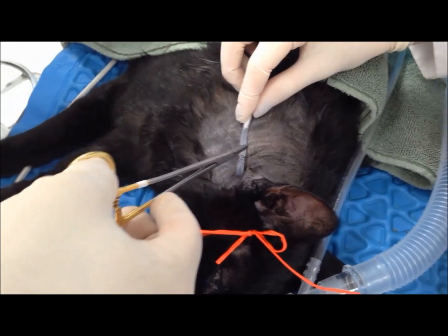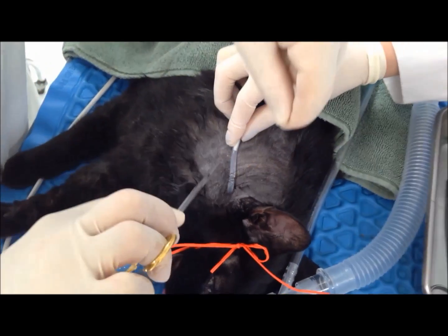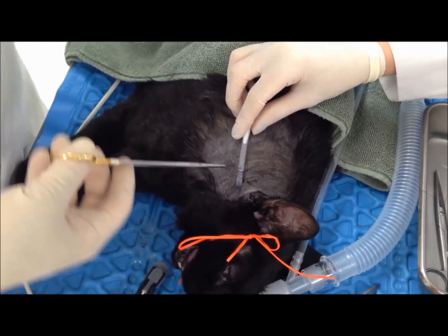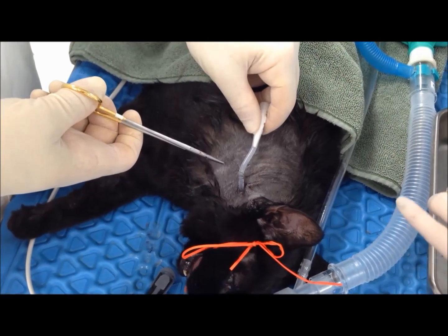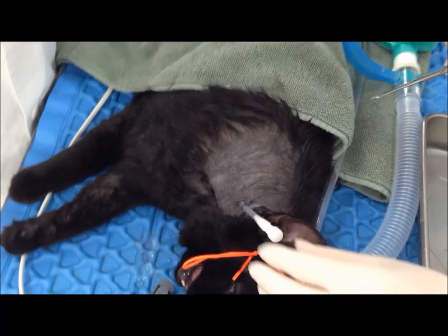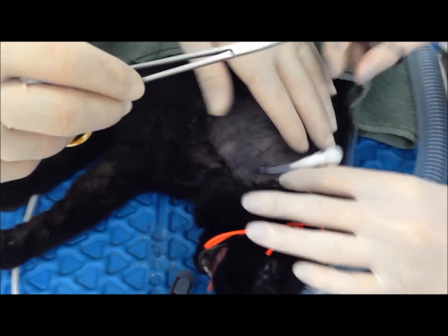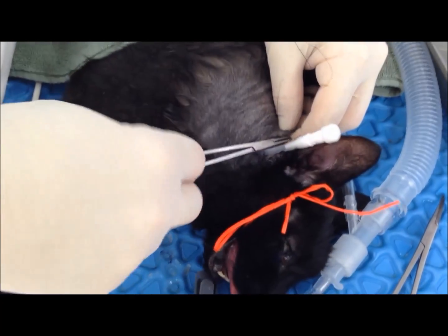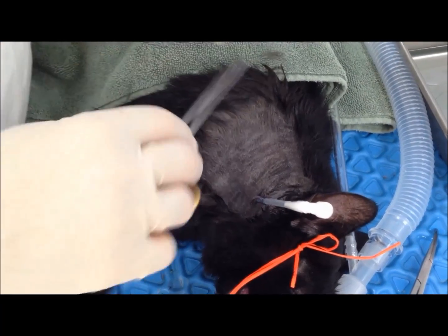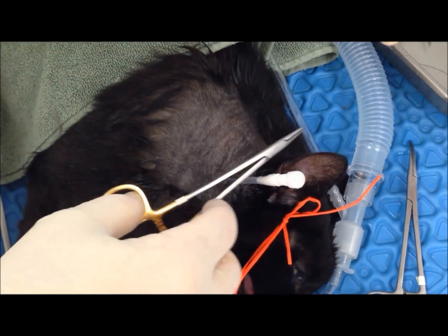It's slipperier than it usually is. And then we do a simple anchoring suture — we just come up here somewhere over the back of the neck. And then we'll see where I want it to go and then place my lip.